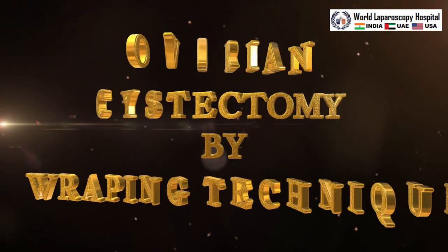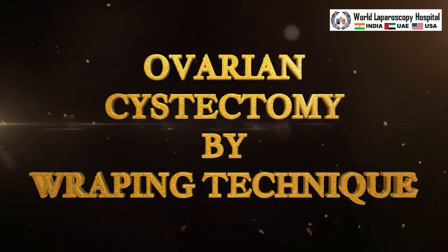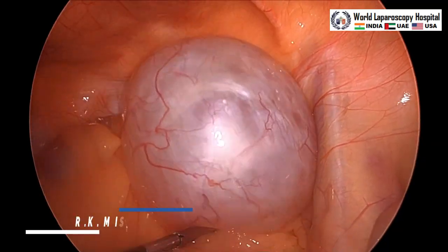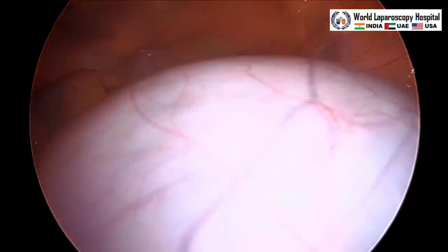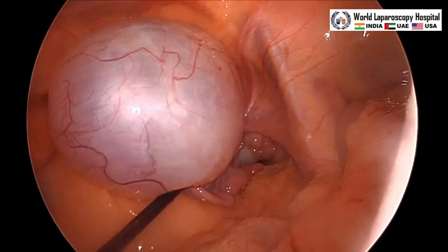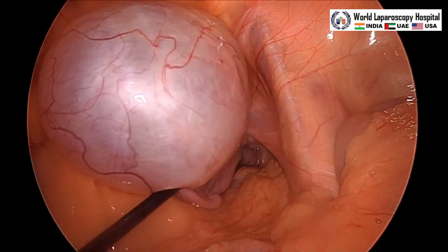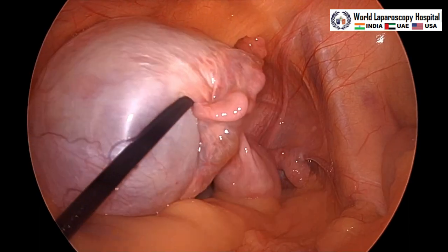Hello friends, this is a case of laparoscopic ovarian cystectomy and here we will show you how to do the ovarian cystectomy by wrapping technique. This technique is very famous all over the world and gynecologists use it to stabilize the cystic wall while they are separating the cyst from the ovarian cortex.